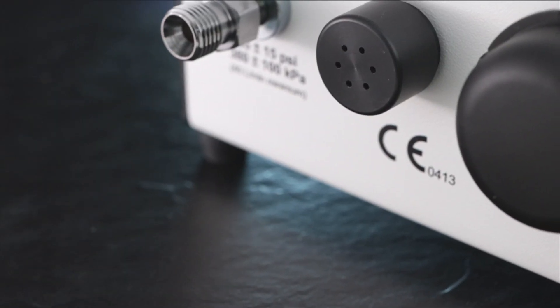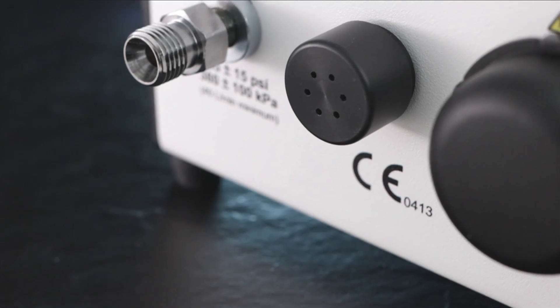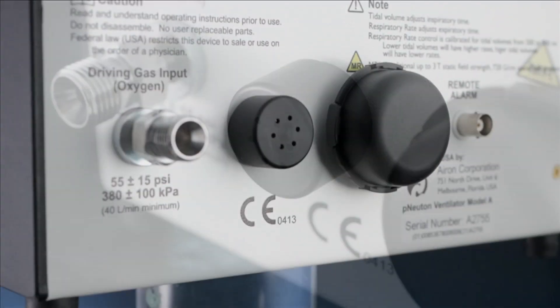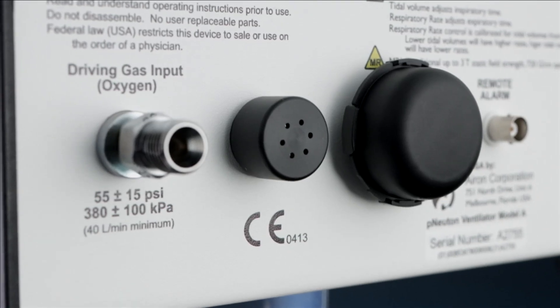Audible alarms. The audible alarm sound comes out of this circle of holes on the adapter. Please be sure to never put anything in these holes or cover them up, otherwise the alarm will not be audible.